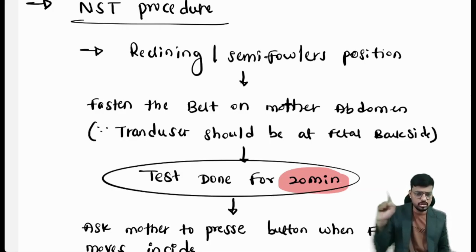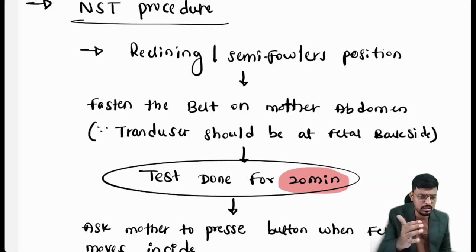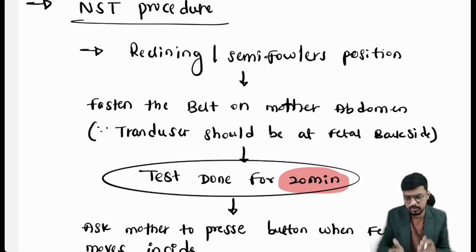If you want to go to the washroom, go now. If you want to empty your bladder, empty it now. If you want to empty your bowel, empty it now. If you want to drink water, drink it now. If you want to do anything, do it now. Once the procedure is started, it should be carried out for the full 20 minutes. That we have to explain to the mother.